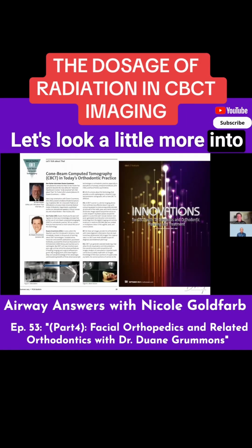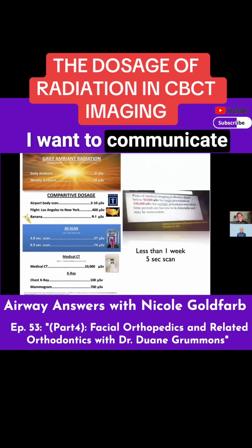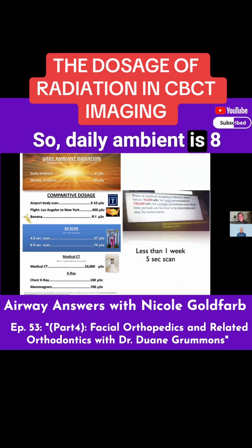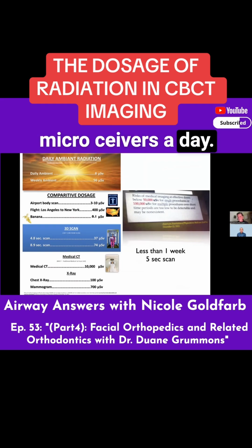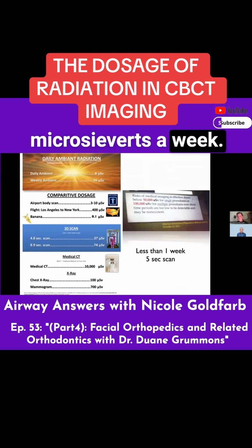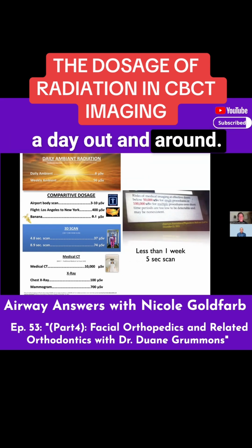Let's look a little more into cone beam then, because I'm relying on cone beam. I wanted to communicate the low dosage, the skin entrance dosage that is occurring. So daily ambient is 8 microsieverts a day. So do the math, 7 days in a week, 56 microsieverts a week. 56 is what you get in natural sun, a couple hours a day out and around.